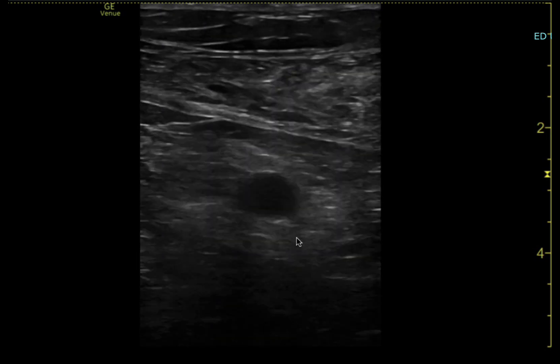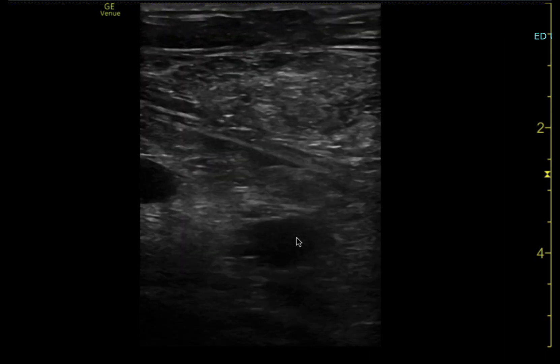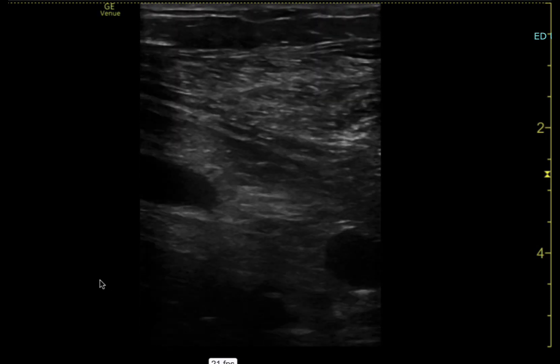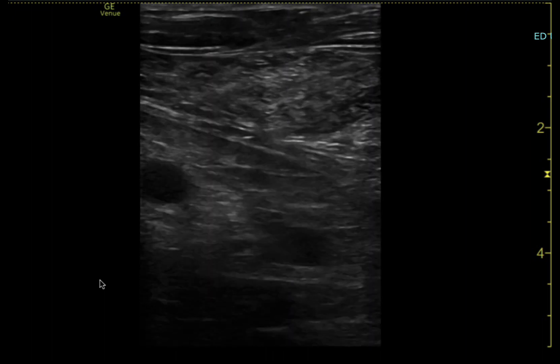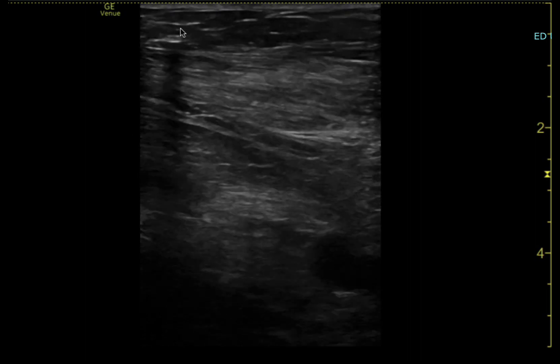This is a good example of why using ultrasound is much better. If you were going with normal landmarks, you'd probably miss the vein and might even hit the artery. I then look at it in long axis — rotating the probe a little bit — to make sure it looks like a good target with a good orientation and approach.